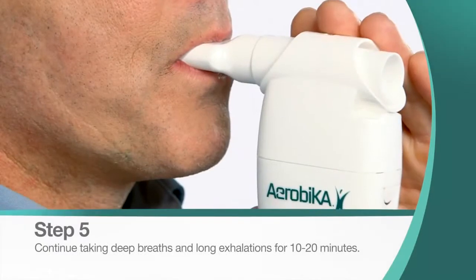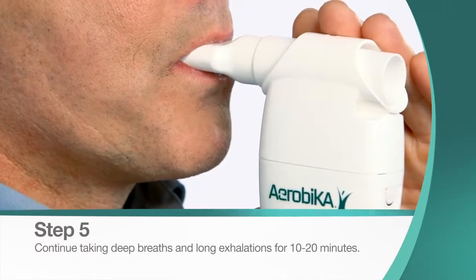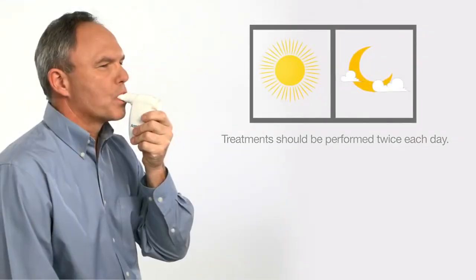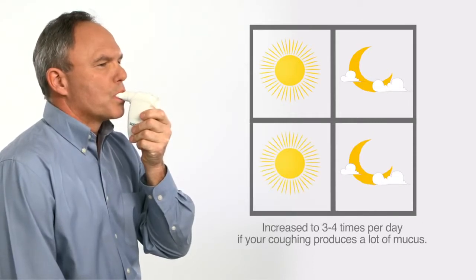Continue this cycle for 10 to 20 minutes, or as prescribed by your health care professional. Treatments should be performed twice each day, and increased to 3 to 4 times per day if your coughing produces a lot of mucus.